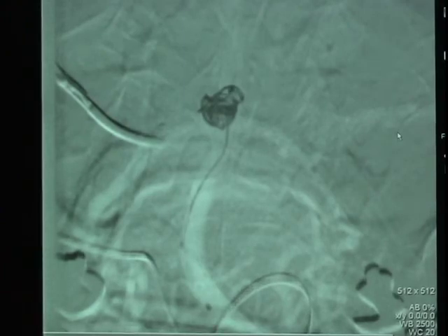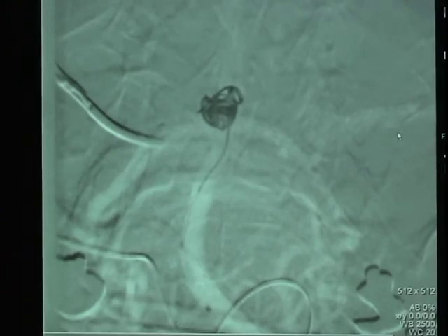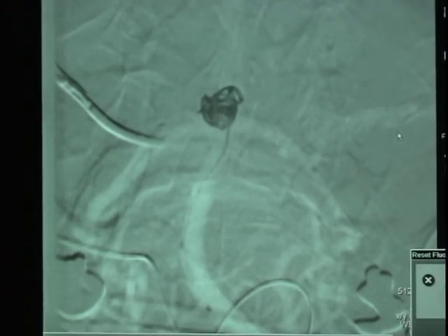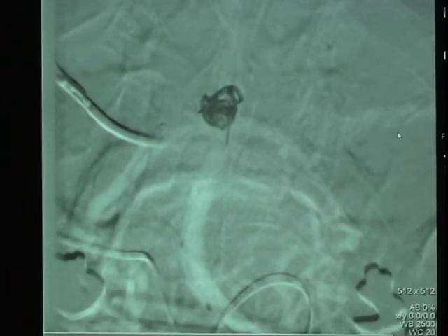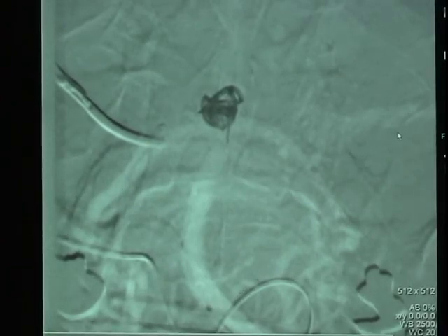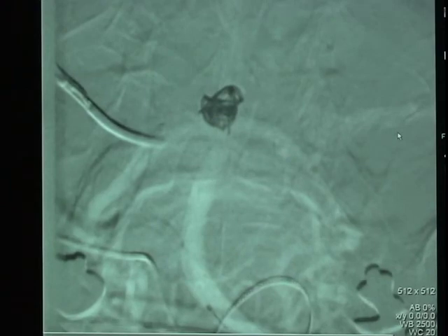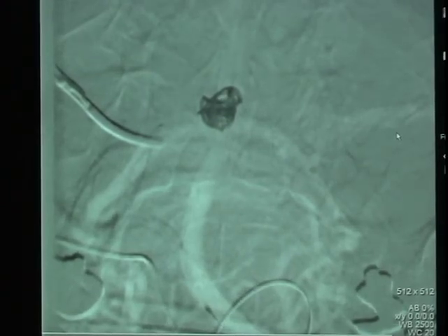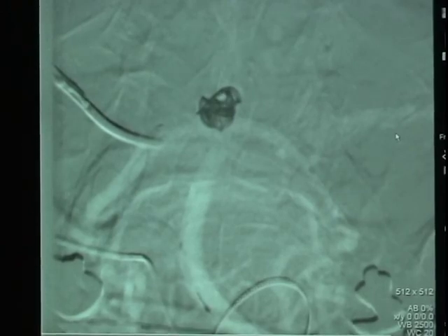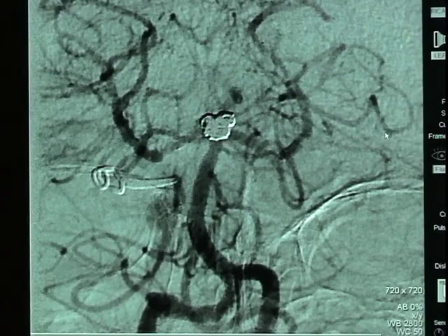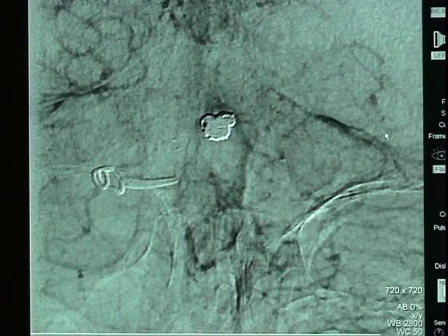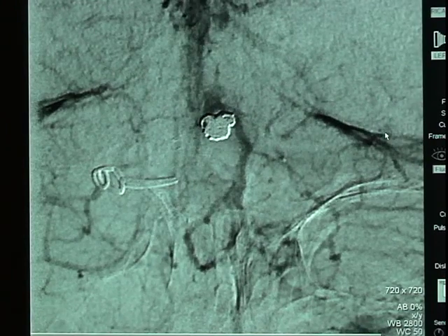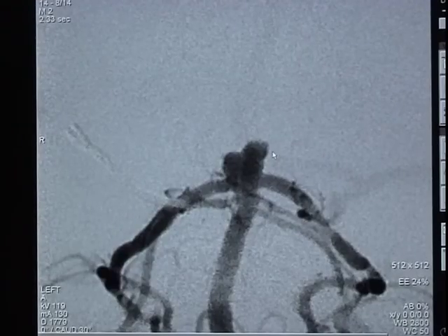This patient has been fully heparinized and at the end of the case will be given Integrilin, a potent platelet inhibitor, as well as Plavix and aspirin as additional platelet inhibitors. At the end of the procedure we have advanced seven total coils. We can see the coil within the aneurysm and all vessels filling.